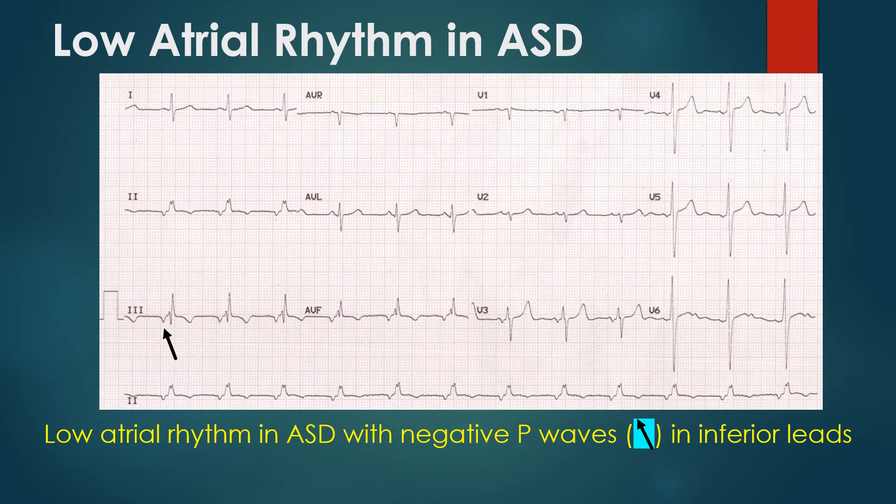Another ECG in ASD shows inverted P waves in inferior leads 2, 3, and AVF. This pattern indicates atrial activation spreading from below upwards, suggestive of low atrial rhythm. Low atrial rhythm can occur with sinus venosus atrial septal defect, as the sinus node may be defective so that an alternate focus arising in the low atrium gives the dominant rhythm.